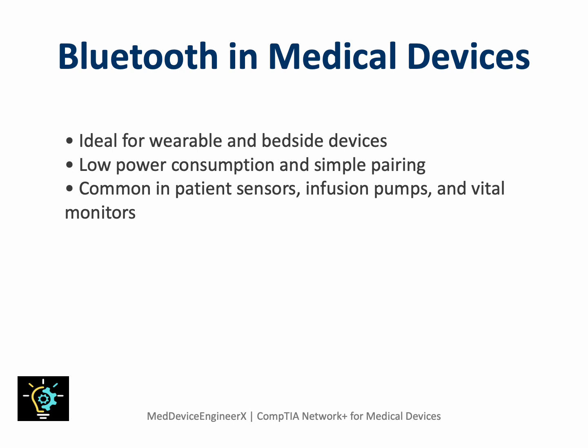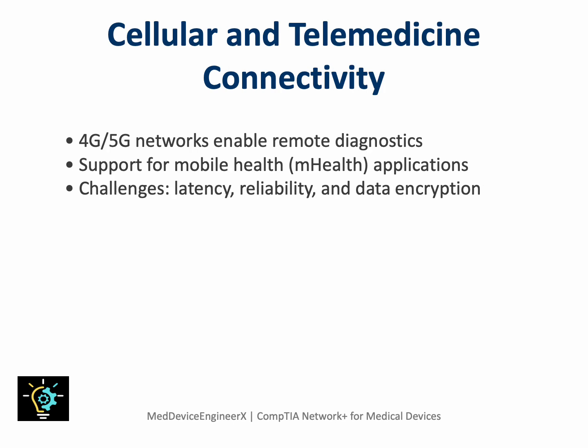However, Bluetooth's short range, usually under 10 meters, means it's best suited for bedside or localized use. Hospitals often use Bluetooth Low Energy to connect multiple devices without draining power. Biomedical engineers need to ensure secure pairing and interference control, especially in operating theaters where multiple wireless systems may coexist. Its convenience makes it a cornerstone of modern connected healthcare.